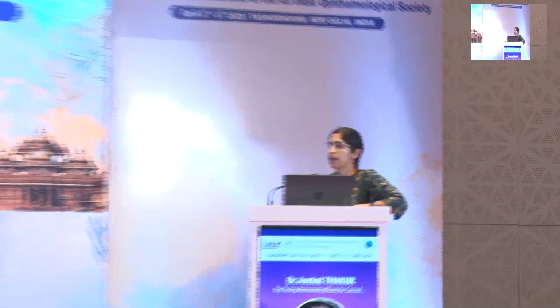Yeah, so Dr. Anchal, could you explain a little bit again how you would use the depth of focus once you've done cataract surgery for one eye, then how do you do it for the other eye now? Yeah, actually the depth of focus is another way to plan monovision or a mini monovision. So once we plan a cataract surgery, we operate the dominant eye first, and we try to achieve maybe plano or maybe a slight minus.